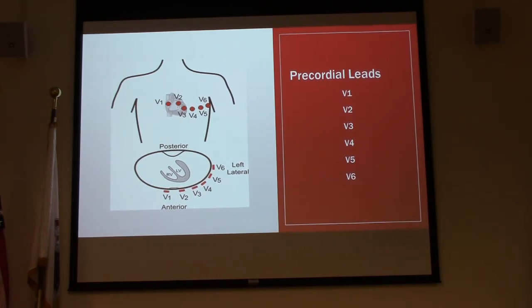But it's the same thing when you put on a 12 lead. When we look at Eric here, it's the same thing as looking at the heart. If you're not doing a 12 lead and using your precordial leads, you don't know what's happening in other areas of the heart. So if you're just using lead 2, it just looks at this inferior wall.